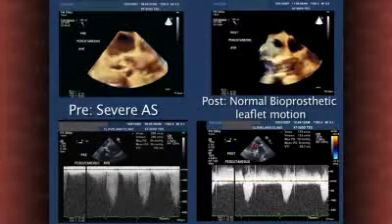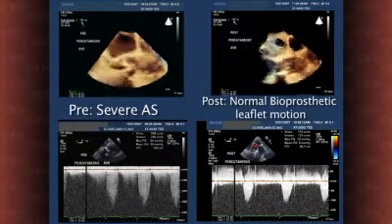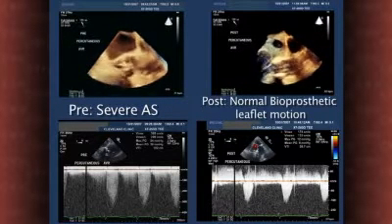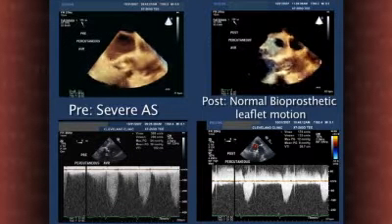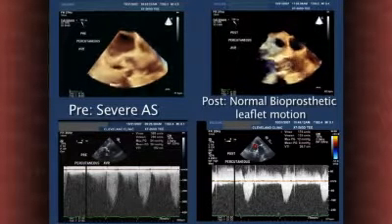I think that the 3D echo, particularly on the transesophageal probe, has, in the early experience, offered some greater ability to see in 3 dimensions, obviously, and to see the medial lateral and the superior inferior aspects of that, to place the crimped valve in the right place, to see exactly where it is, to be able to see in 3 dimensions is of great help. And I think that will be true across other procedures which are catheter procedures as well, even more so. The percutaneous aortic valve replacement, in a way, is an easy procedure because there's kind of only one place it can go.